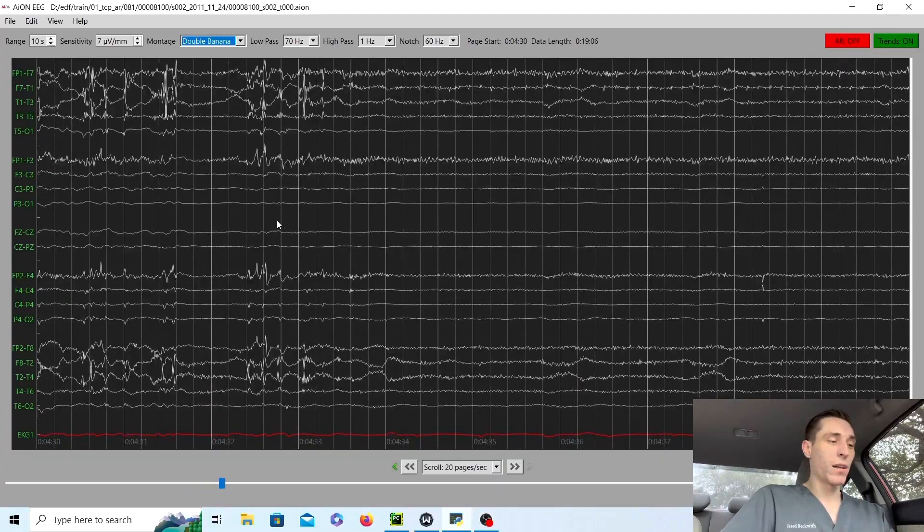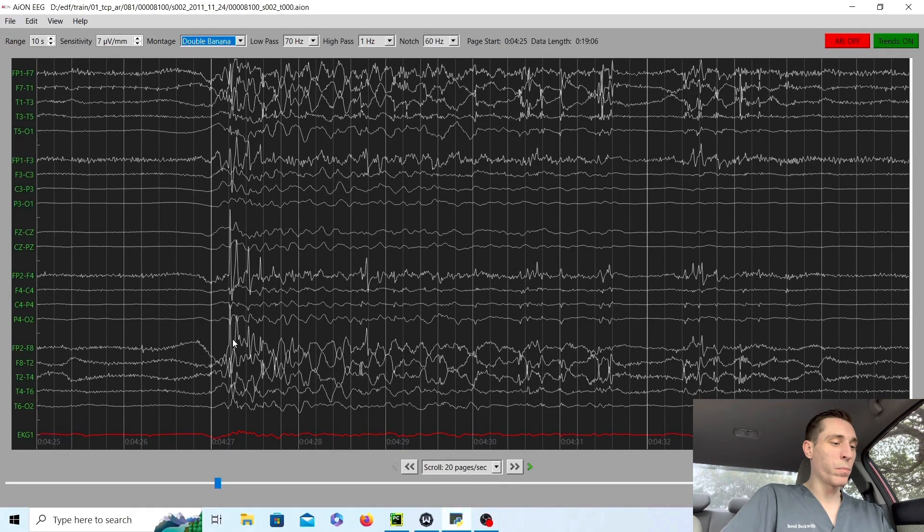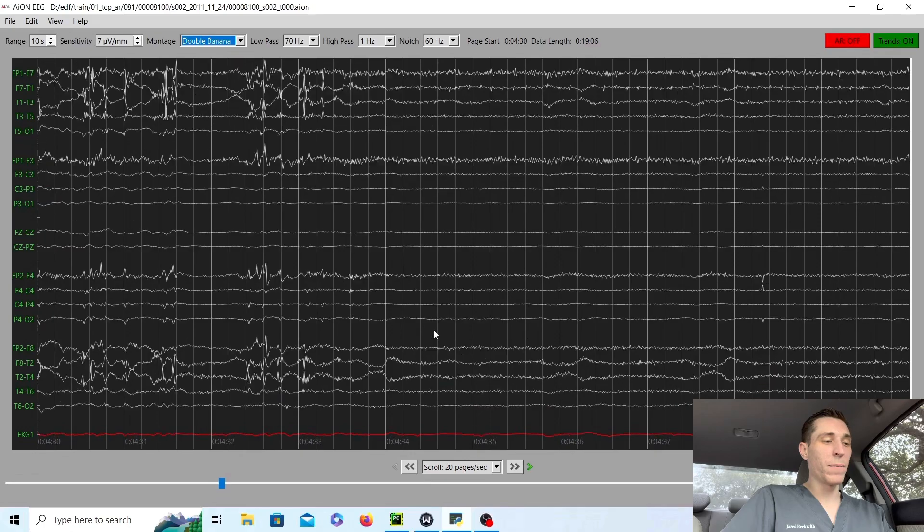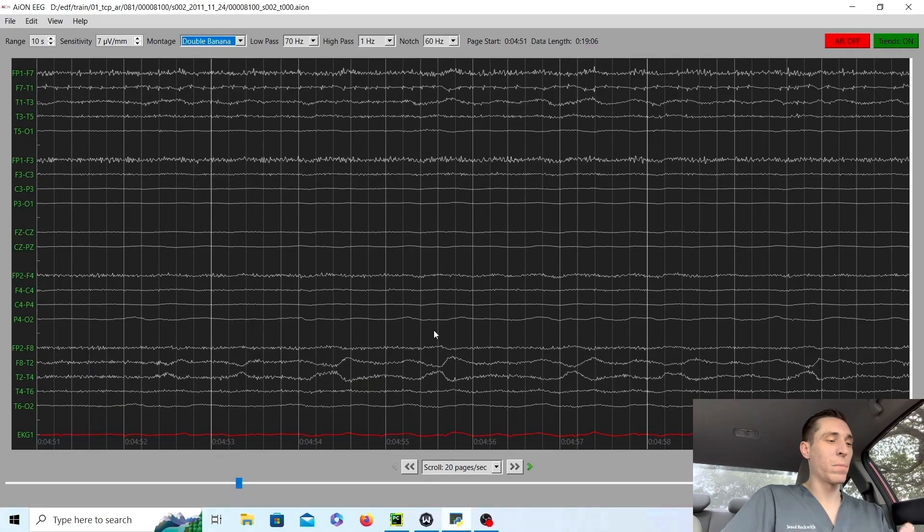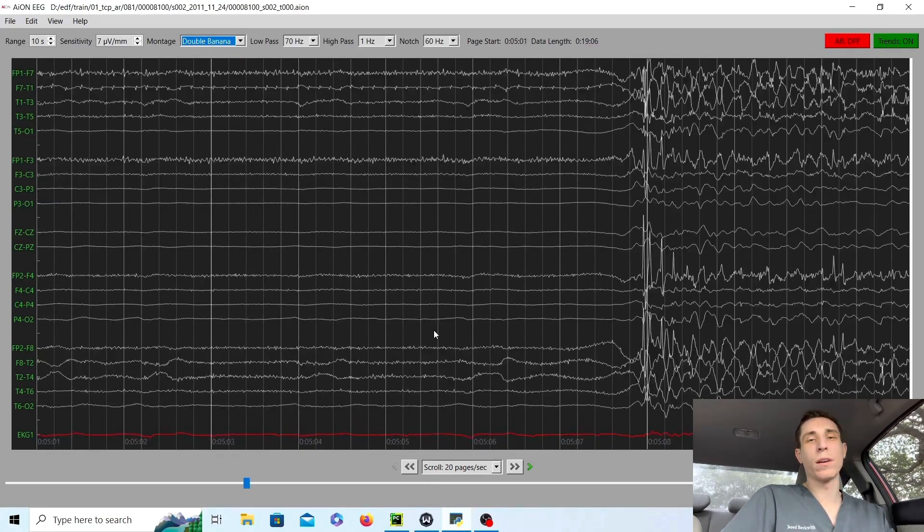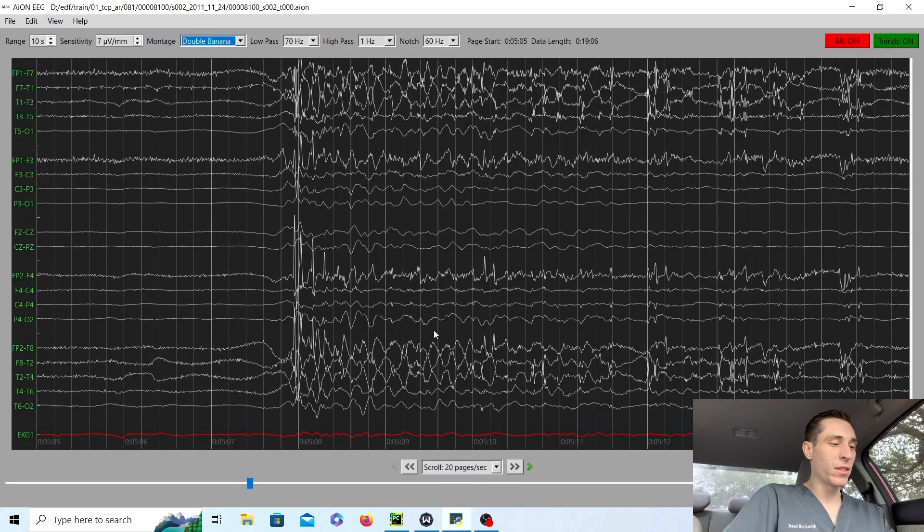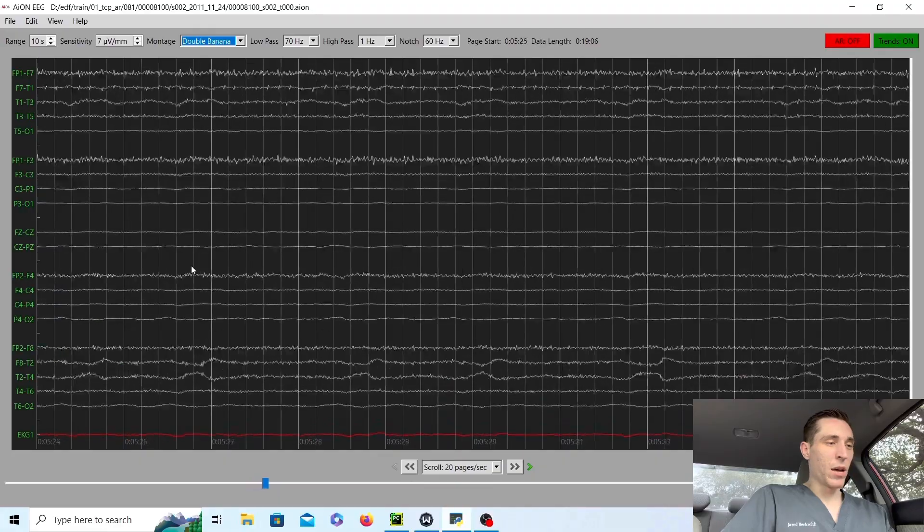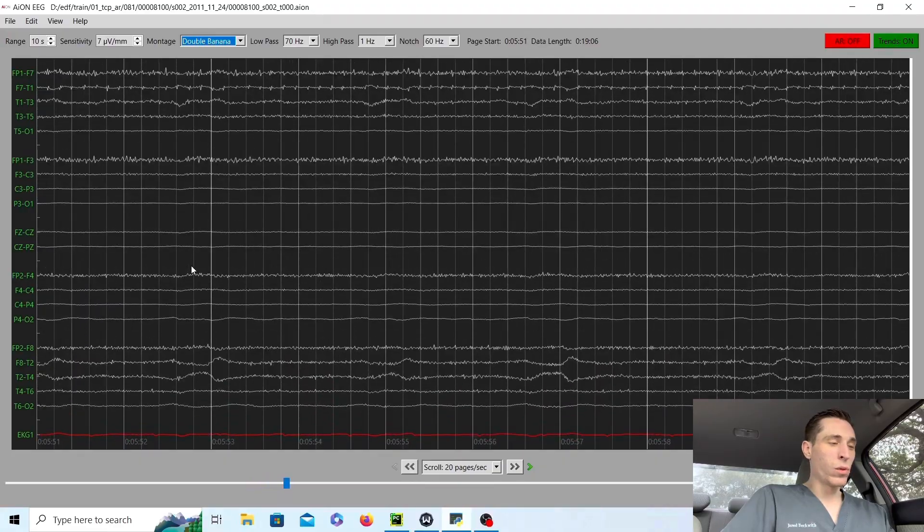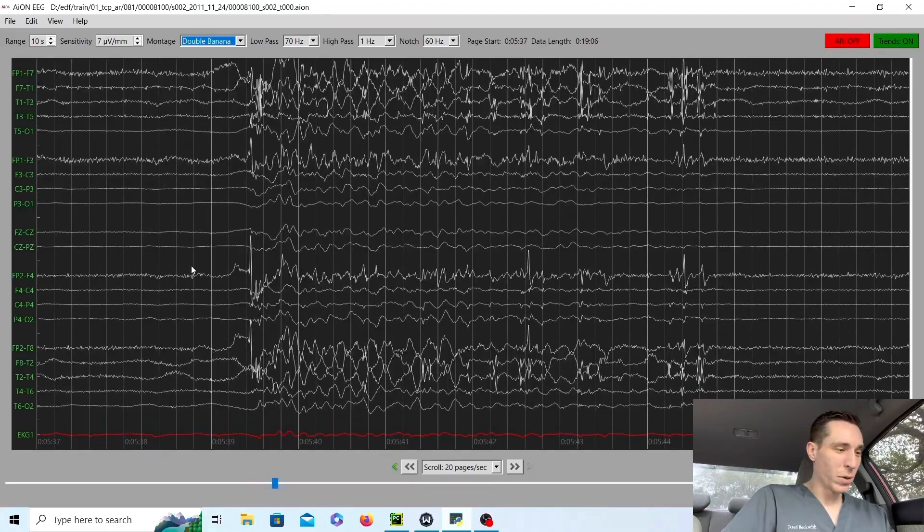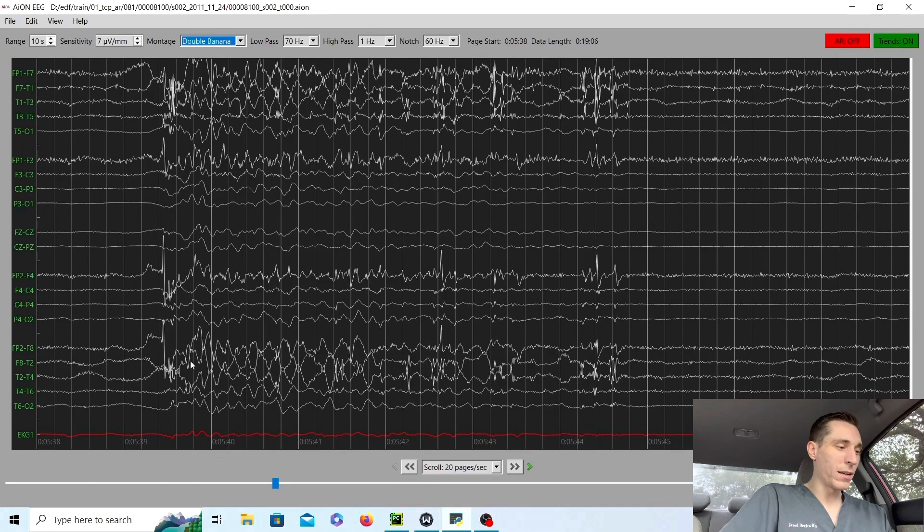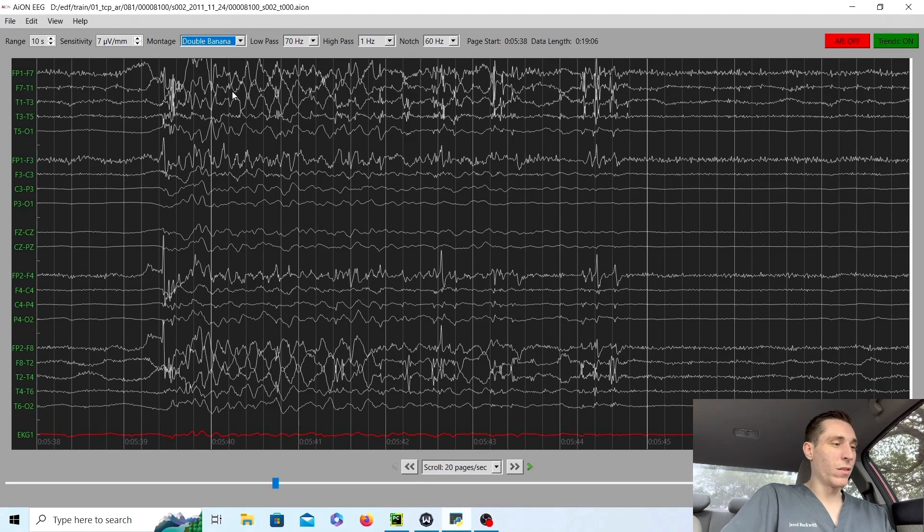Cycling from completely almost flat to a short burst of activity. And during this activity in the history, it said that the patient would have a little bit of a twitch in their face with every burst of activity. Now, if you want to localize these bursts, they're more prominent in the frontal regions, but it's essentially the whole brain.